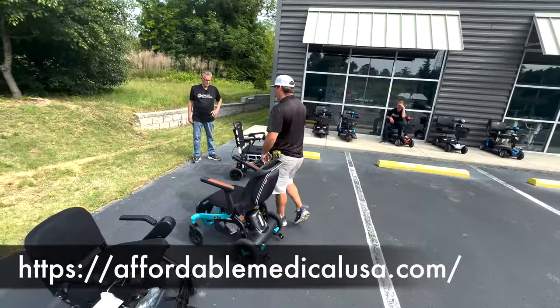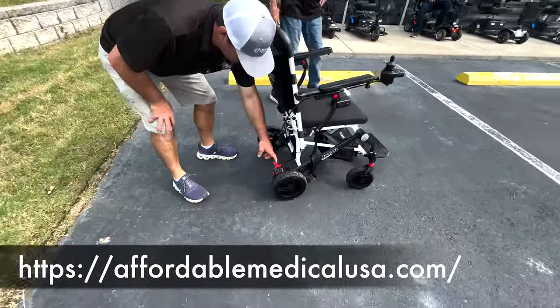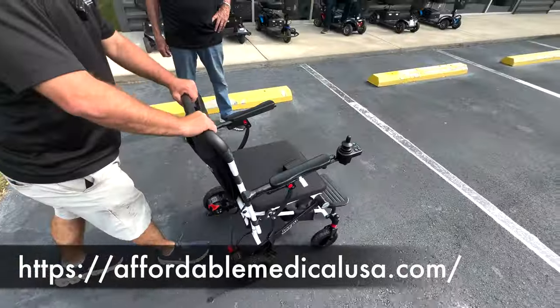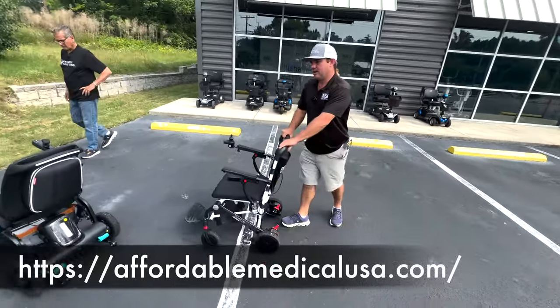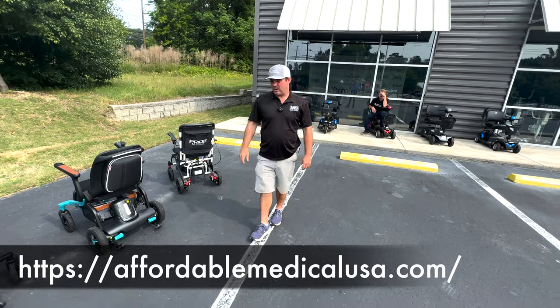And then we're gonna get over here to the carbon. The same thing. You can do your foot if you're very light, but that's the push. Then you can push it. All of these have to be turned off to push. So you can use this as a transport chair, but once you flip it back, they can use it as a power wheelchair.